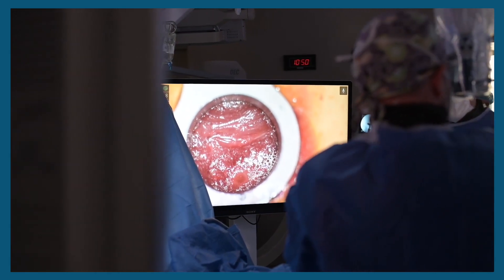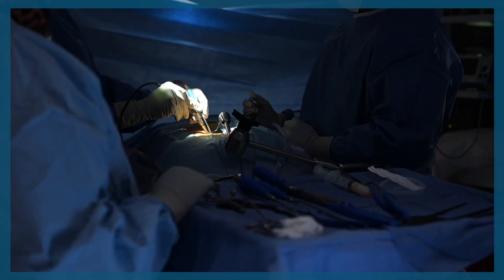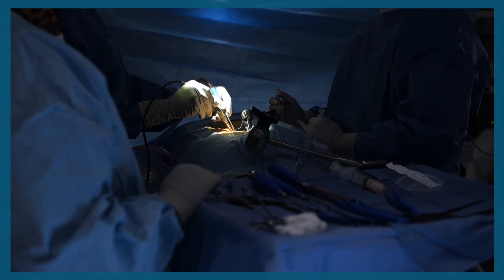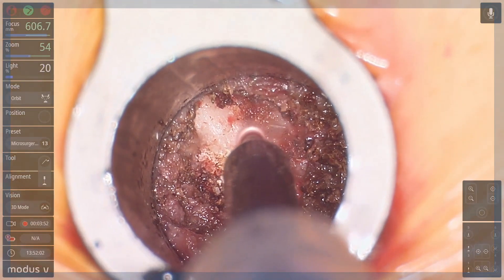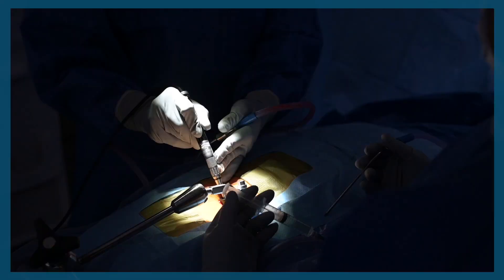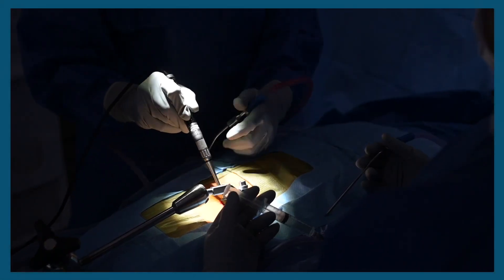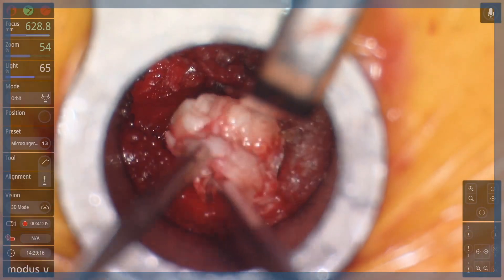which is the bone just next to the nerve roots in the low back. After you've docked down with one of these dilators, you can place a minimally invasive retractor system, which looks like a small tube attached to the bed. At that point, you drill away some of the bone, remove what's called the ligamentum on top of the nerve roots, and gently retract the nerve root over and take out the herniated disc.